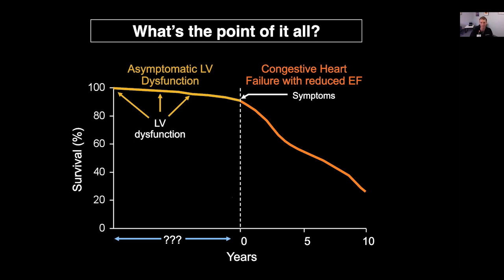In terms of the critically ill, my argument would be for something like the right ventricle. If you could use speckle tracking to pick up some subtle RV dysfunction, maybe we could institute measures such as reducing PEEP, watching for fluid overload, and instituting earlier catecholamines rather than fluid. Maybe these are some of the measures that may be able to help in the critically ill.